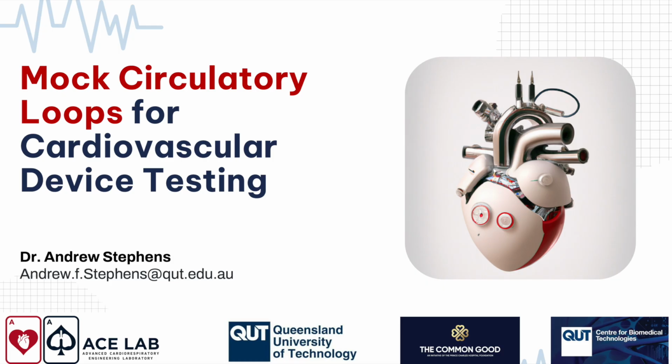So we do it pneumatically, as I said, but you could also do this using a linear actuator by measuring how much blood is being returned to the heart, how much pressure is in this box, and then pushing harder. This is something called a pressure volume loop. This is how doctors see the Frank-Starling mechanism, and the mechanism there is represented by this line. So the more full it is here, the further up this line it has to pump.